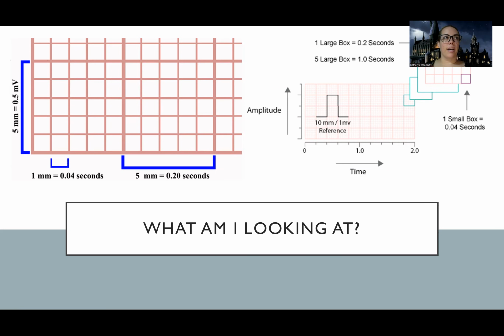Those would be the main ones that we test you over, because those are the ones that actually affect the rhythms, unlike the P wave size and T wave size. Really what we want you to know is the normal PR interval, because if it's too long, it will cause a block. And then we also get into ventricular rhythms when my QRS gets fat.